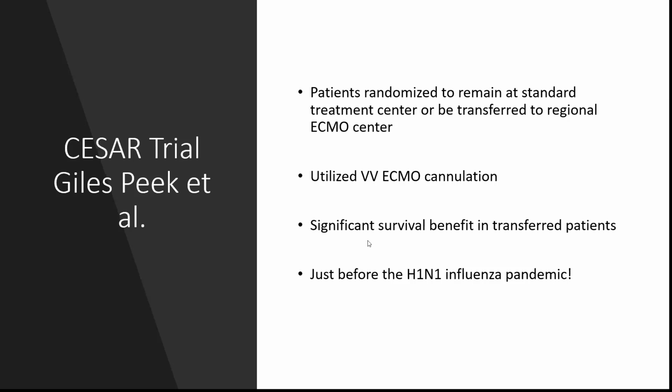So people take different things from this. Some people say this shows that ECMO has a benefit in patients with severe ARDS, and other people, which I think is the appropriate conclusion to be drawn, say patients do better when they're transferred to an ECMO center when they have severe ARDS. But the thing is, this CESAR trial gave a little bit of hope to ECMO believers, and this happened just before the H1N1 influenza pandemic. So I mean, we're going through a pandemic, right? So when you have a patient that has severe ARDS and they're a young, healthy patient, and you have them on high vent settings, you have nothing else to offer them, this offered some hope in another modality.